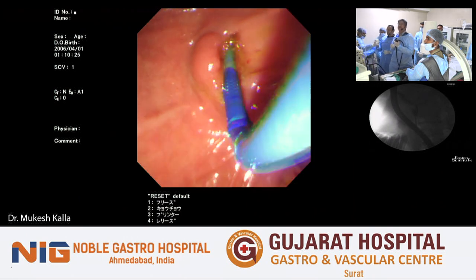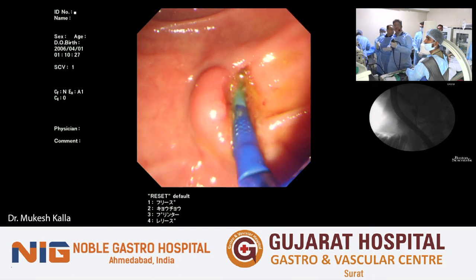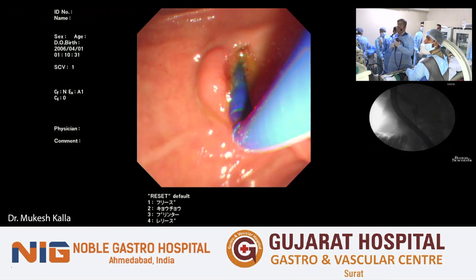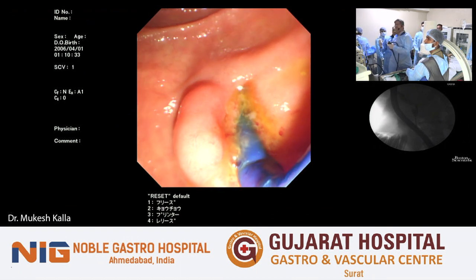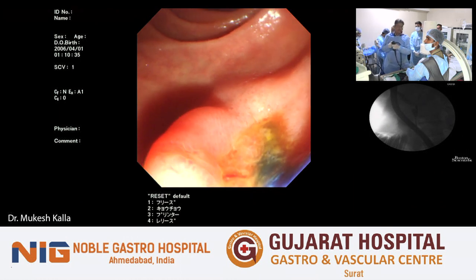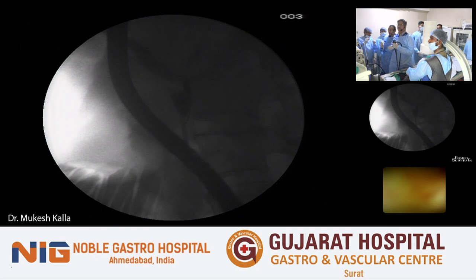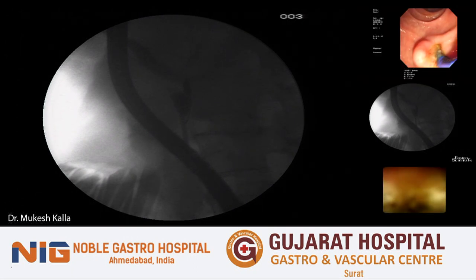Would you like to change anything? Yeah, I'm there. Yes, sir. Would you like to change any technique? No, I'm already inside. Show the cholangiogram once. So sir is inside. So now putting a wire, maybe we can avoid right now. Yeah, we can defer that idea. Just visualize the bile duct and then we will decide. Where is the water irrigation?